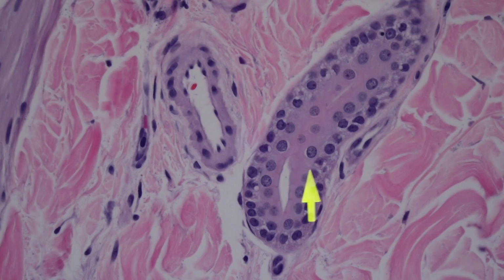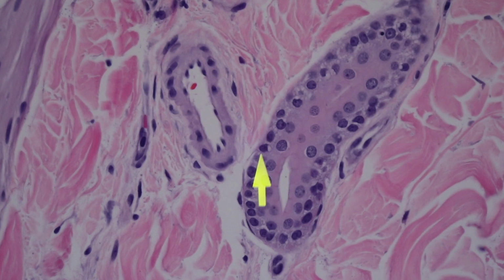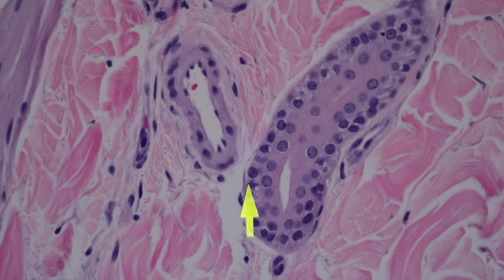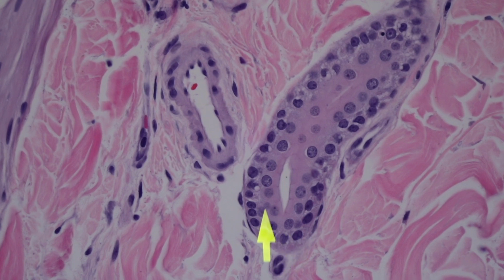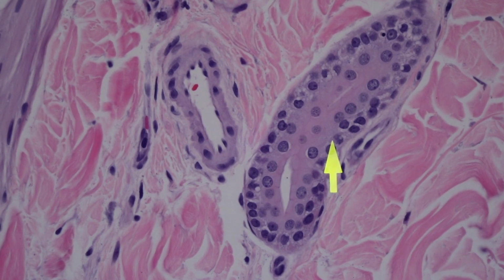The inner layer is this layer right here that's more pink. And then this outer layer is actually made of a special cell type called myoepithelial cells. They have a little bit of contraction properties, supposedly. I don't know how much of that gets actually used here, but they do have some contractile filaments in them. So they have a little bit of muscle-like quality. So that's the myoepithelial layer on the outside, or the basal layer, some people might call it. And then the inside is the apical layer, these larger nuclei with pink cytoplasm. So it's a double layer of cuboidal cells.